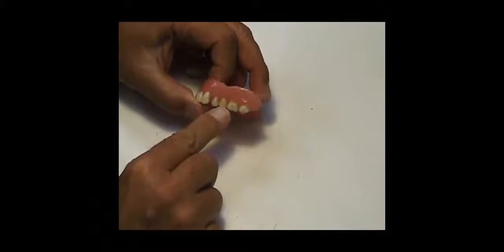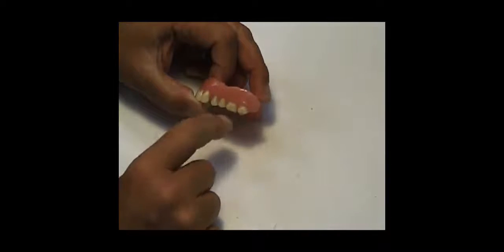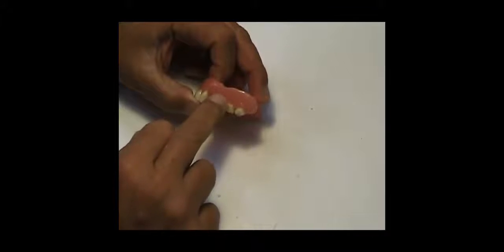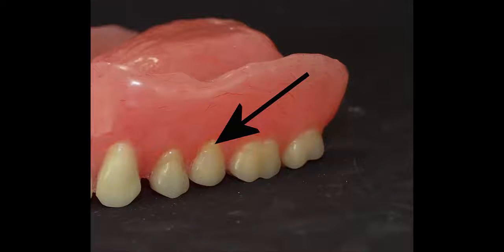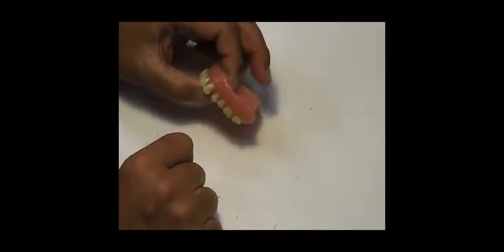I took A2 self-curing resin and patched it, smoothed it out, then applied Opti-Glaze Clear to seal the whole thing. I won't have any issues with that.